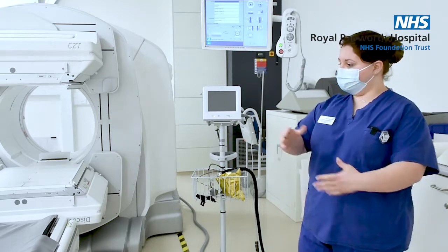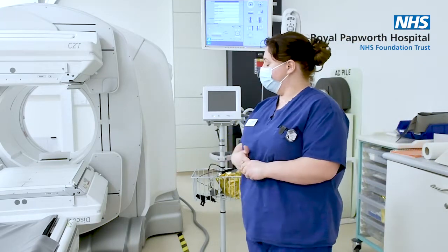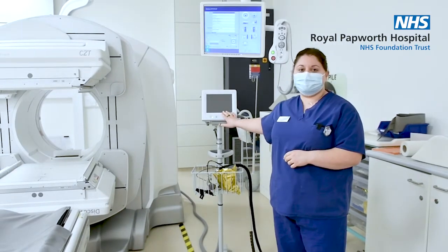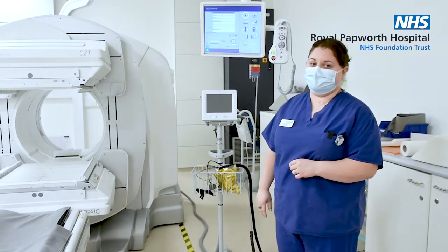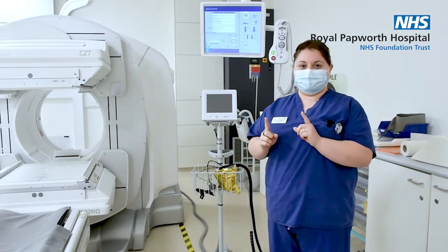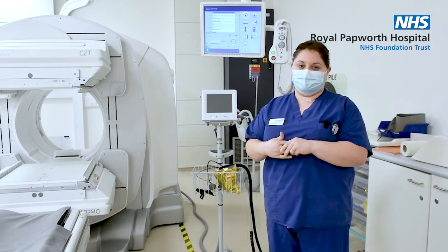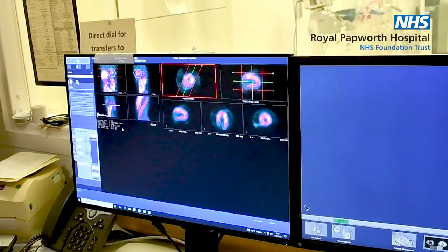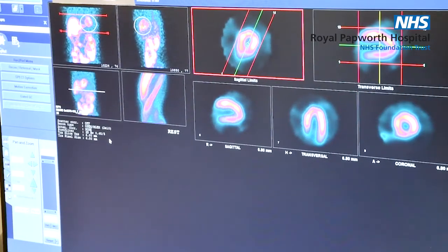As we do the scan, our patient will be laying on the table here and we attach four little ECG leads, which basically monitors the patient's heart rate whilst we're doing the scan. The scan can measure the length of each heartbeat and then when we do the reconstruction of the images later, it breaks all of the heartbeats down into little sections and then creates a 3D reconstruction, allowing us to look at how the heart is contracting.